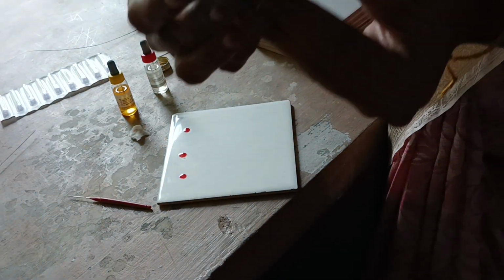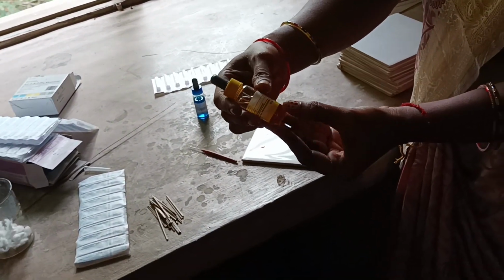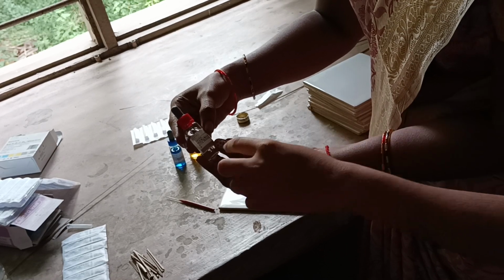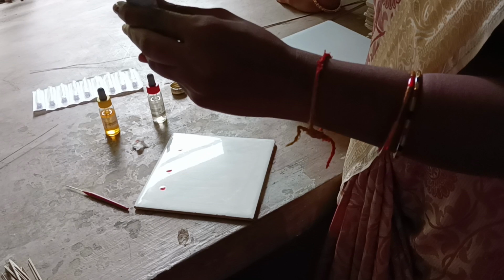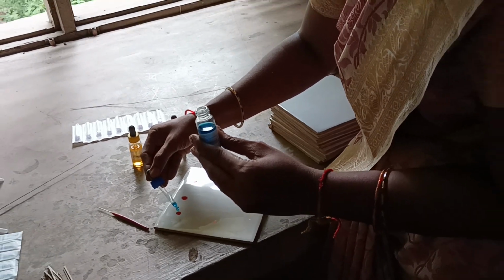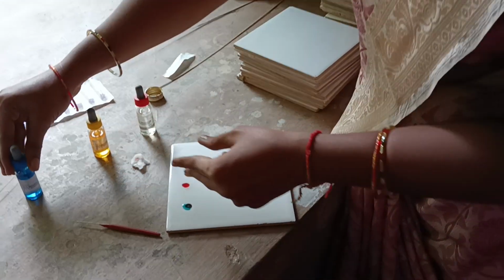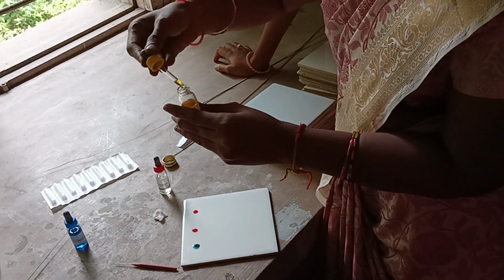This is called anti A serum, and this is anti B serum, and this is anti D serum. In the first drop of blood we are adding only a small drop of anti A, and then in the second we are adding a small drop of anti B serum.